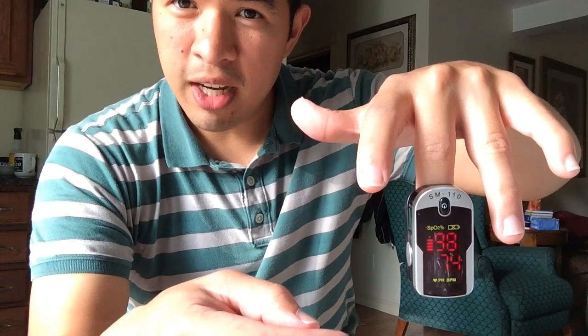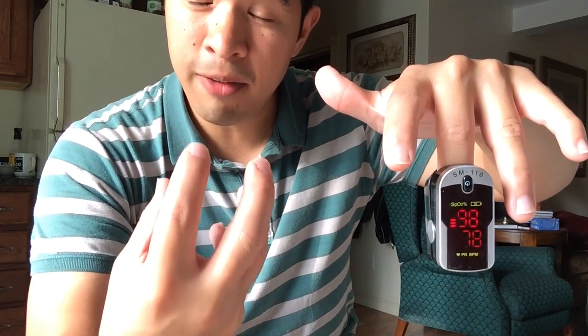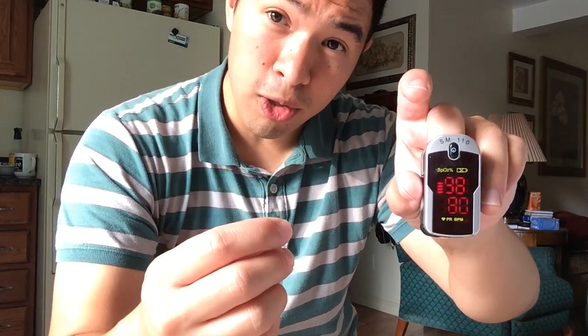One of the big differences between this unit and others you can find at places like Walmart or medical supply stores is it has this retro display, which is actually really easy for me to read. The other units tend to have a more modern display — not this old retro style — and the characters and numbers tend to be smaller.